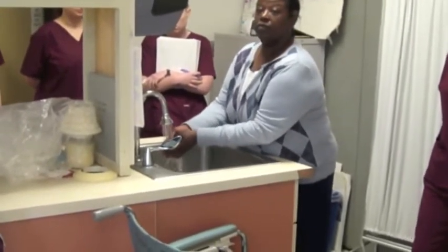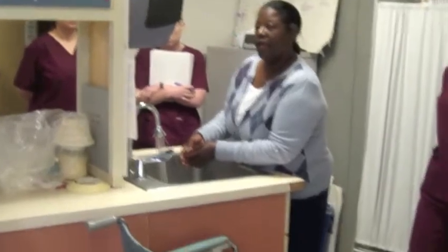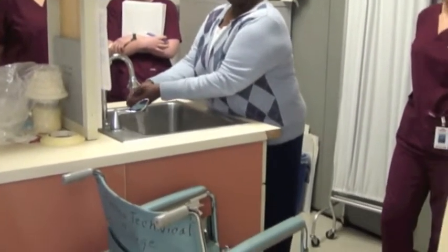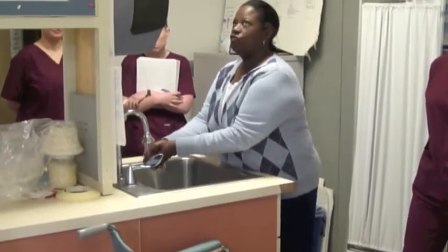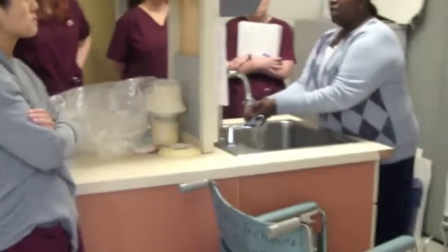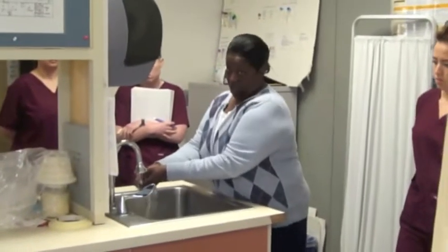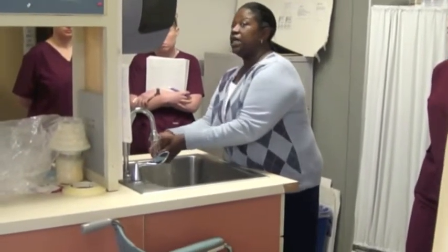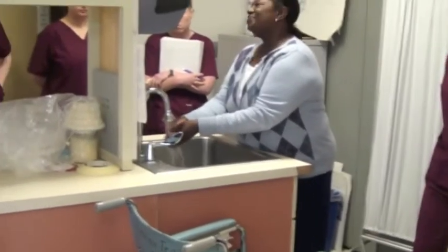Simone, how long are we supposed to clean the tops of the bottles for? Oh man, I didn't clean my tops of bottles. I'm sorry. You gotta clean your tops of bottles. That would have come between, you see, when I tied the tourniquet and did the alcohol on the arm. That's where I needed to then go over and clean the tops. But how long? Is it a minute each also?